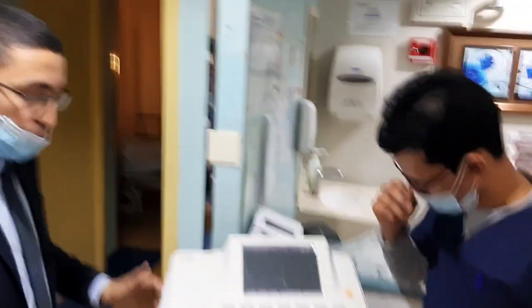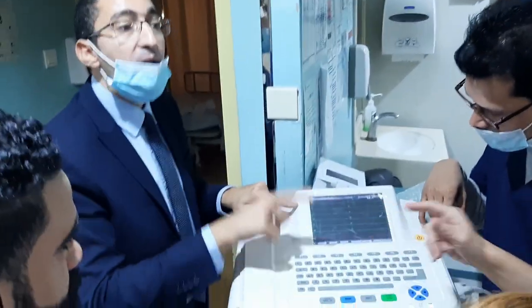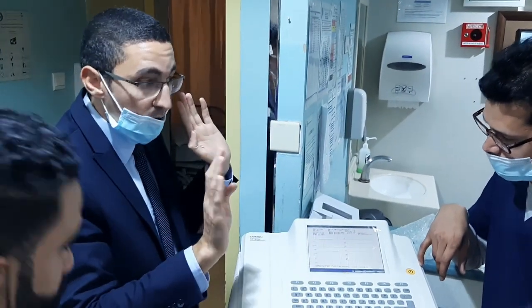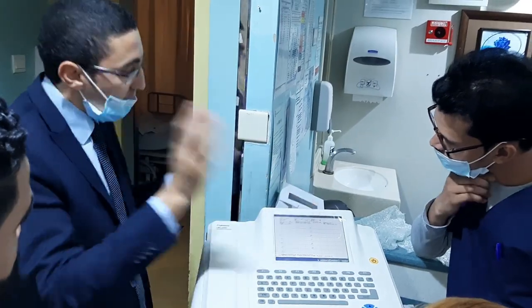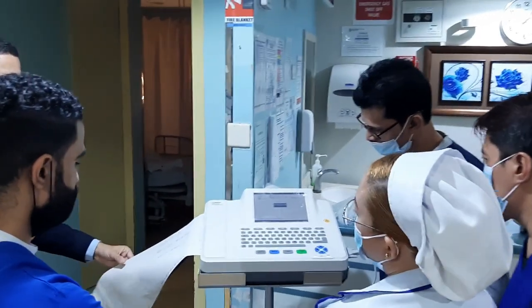It's helpful for you, to save paper. This is most doctors' preference, and it's the default, but you know how to change it. You can make it 12, you can make it 6, as you like. This one's a preview, and this is the normal default. The doctor wants it as he likes. Now we can print. Press F6.